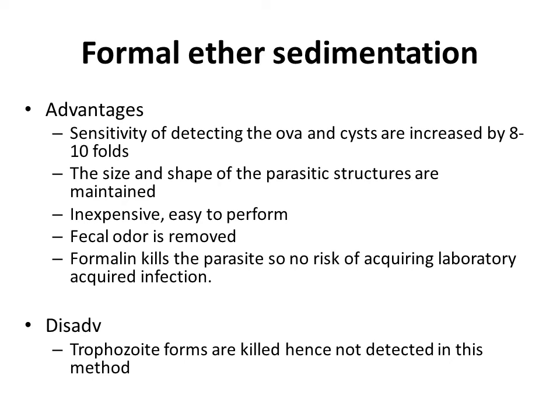Another thing is that the technique is inexpensive and easy to perform. There are no special equipments needed, so we can easily do it in our laboratories. And fecal odor is removed. Normally our feces sample has an odor, so when we use formalin, it reduces the odor of the feces.